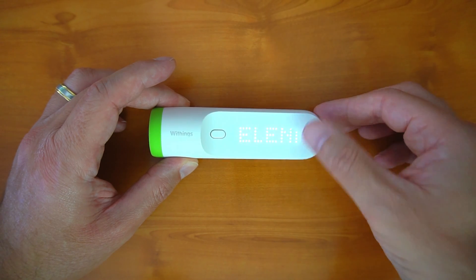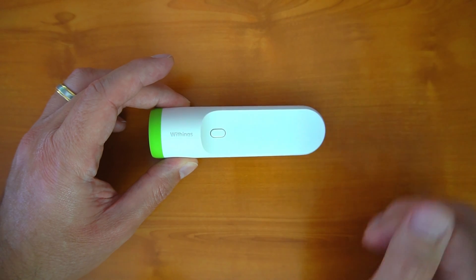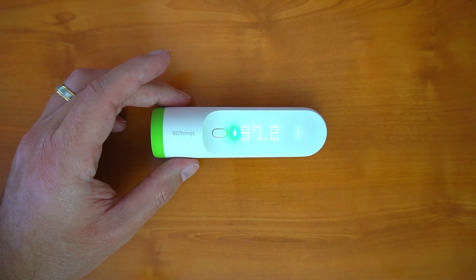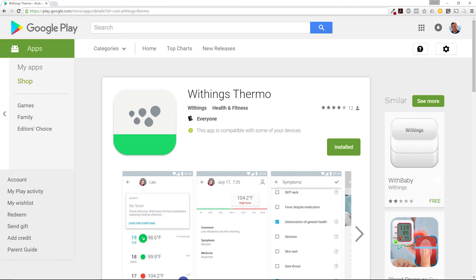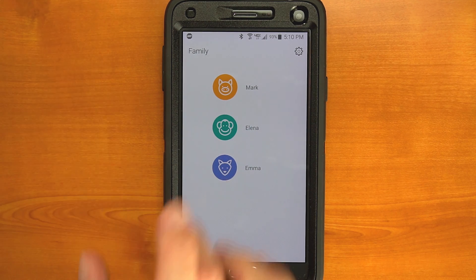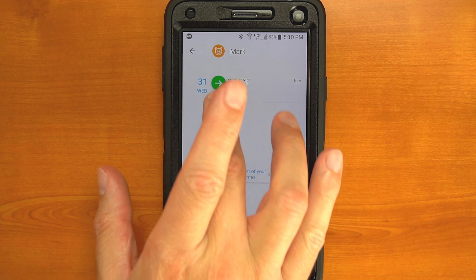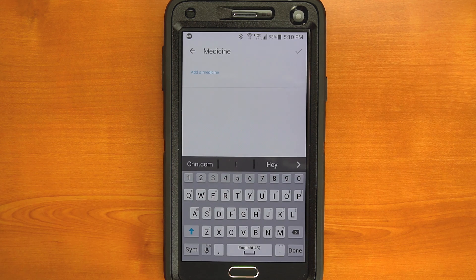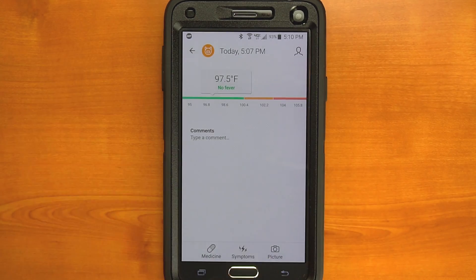From there you can use the capacitive interface to select the corresponding profile that the temperature belongs to. The Thermo supports up to eight different people. Once you've found the corresponding profile, hit the button to lock it in. It takes about a minute or two before you see this time-stamped measurement posted to your Withings account. Once it's there, you can access it through the web, or for a more compelling experience, use either their Android or iPhone app. The app experience is where the Thermo really shines because you can add a bunch of other data or information with regard to the illness you're tracking. You can add things like the medicine you're taking, the symptoms you're having, and even take a picture to track the progress of illnesses that have physical manifestations like rashes or bites.